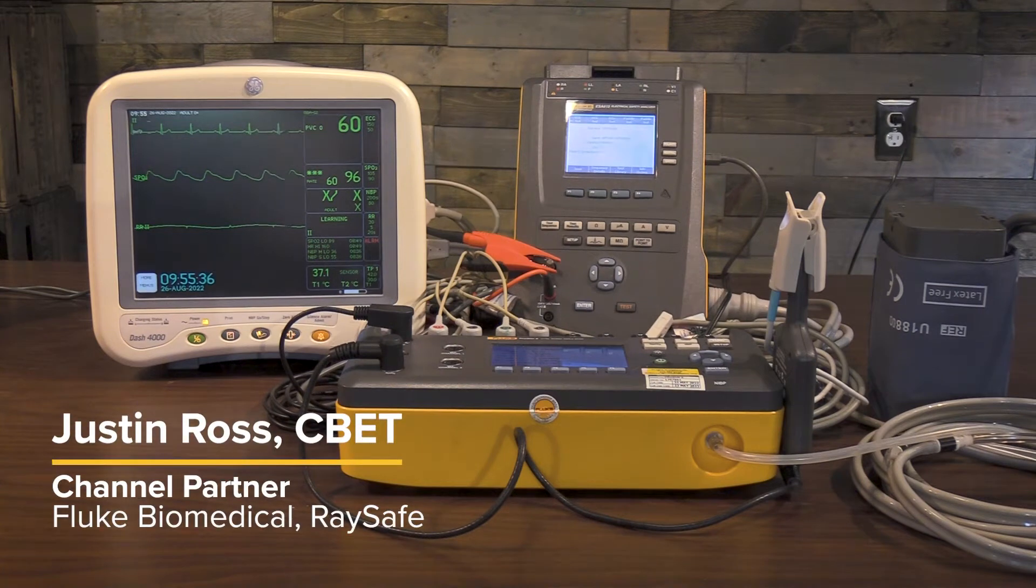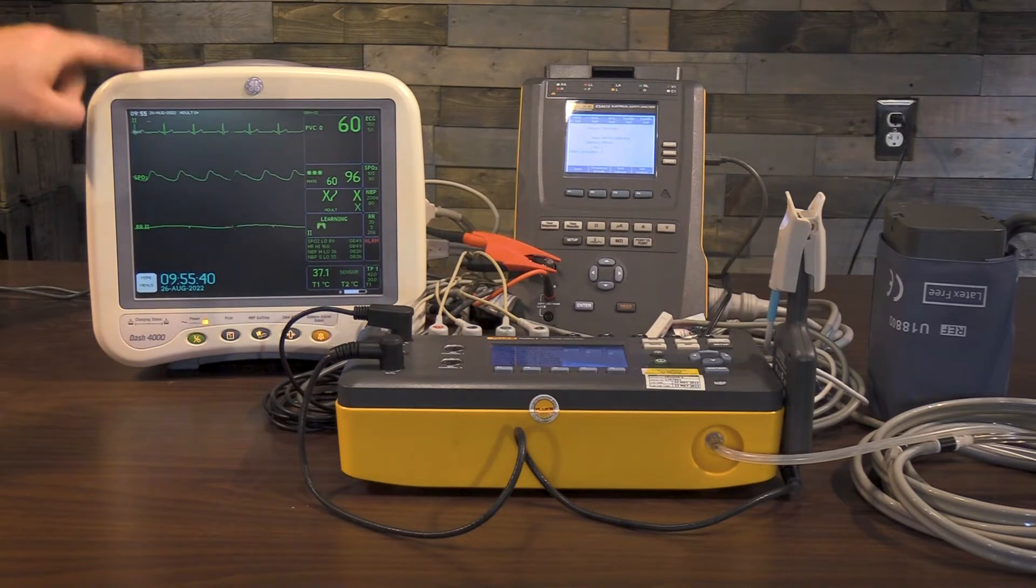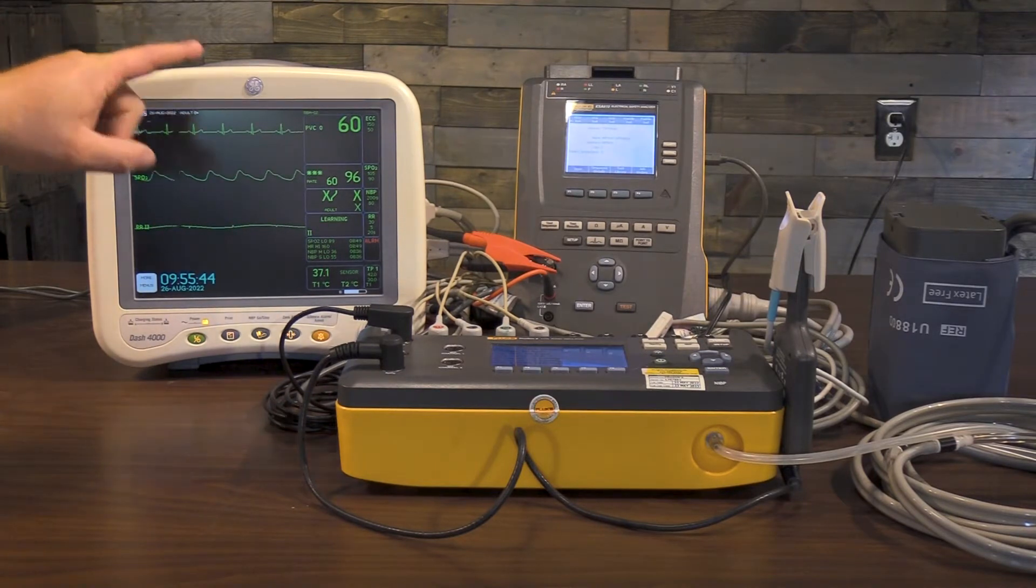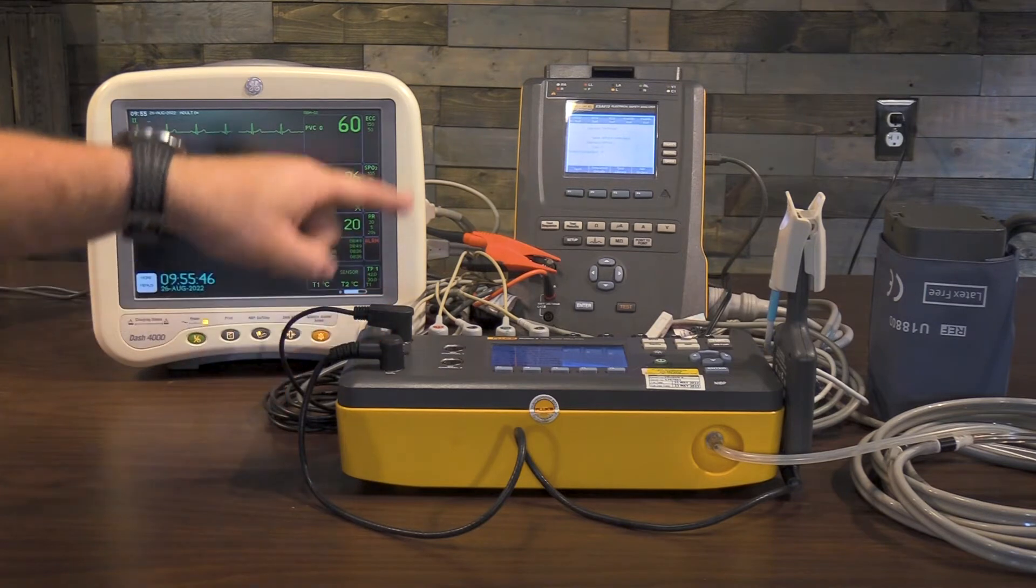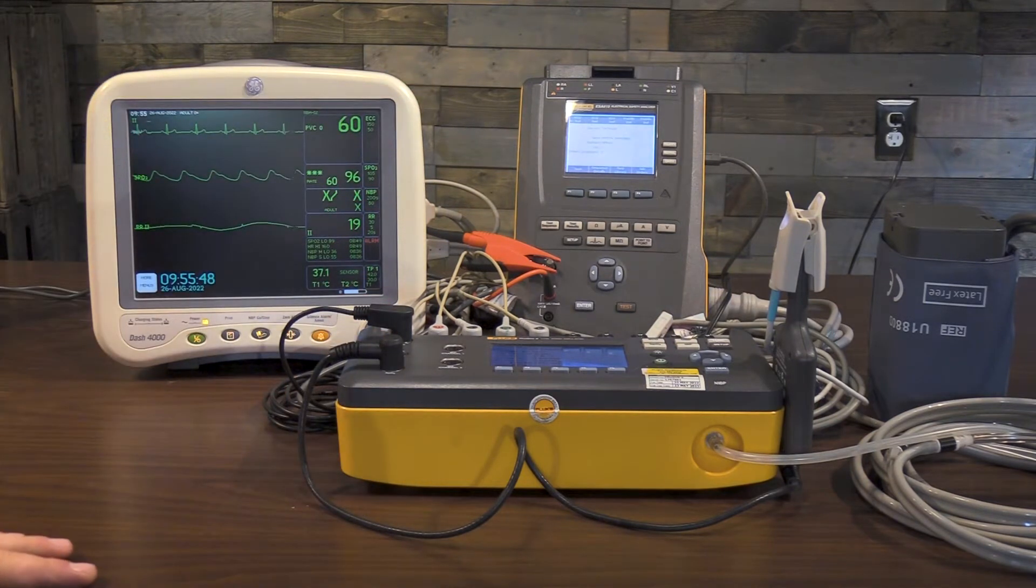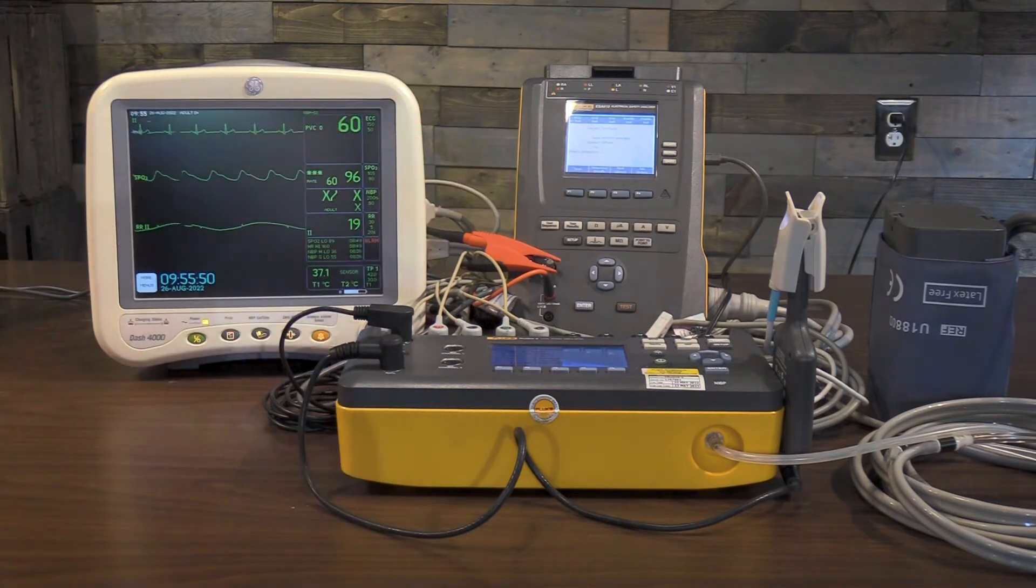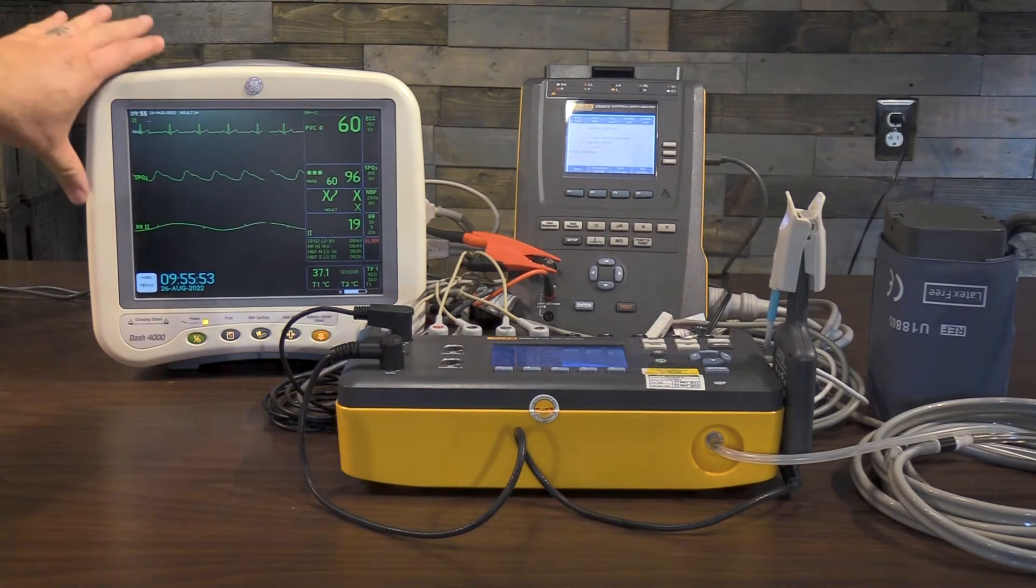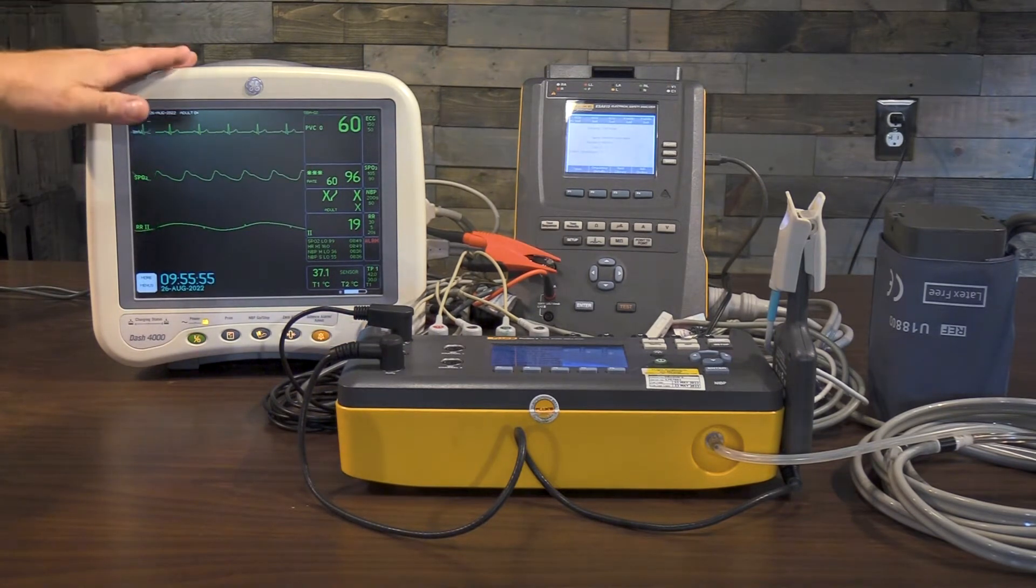In this video, we're going to show you how to do an alternative maintenance check-in procedure on a GE-4000 patient monitor utilizing the Fluke Biomedical ProSIM-8 and the Fluke Biomedical ESA-615. Both of these devices are connected to OneQA at one time and I'll be able to run through the entire check-out procedure of the Dash-4000.